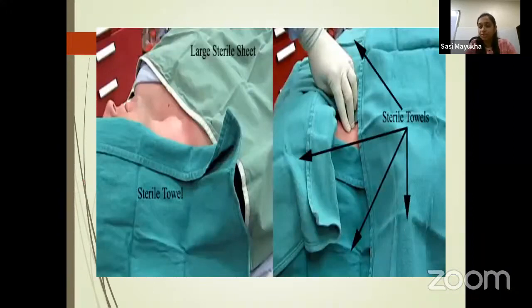So this is how a patient should be draped, because sterile precautions are very important for central line insertion. Catheter related infections are very high when the aseptic precautions are not strictly followed.